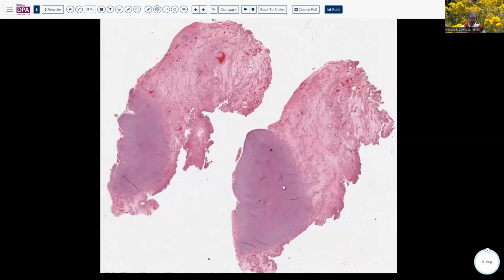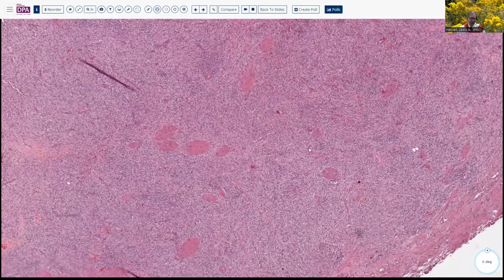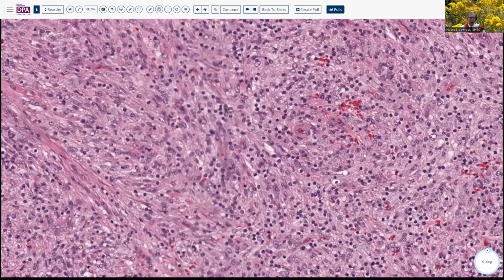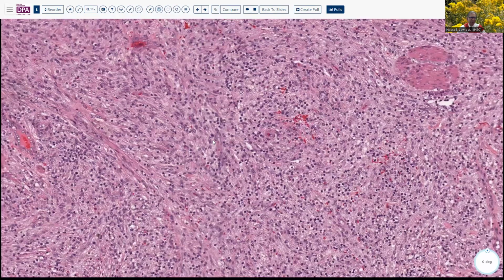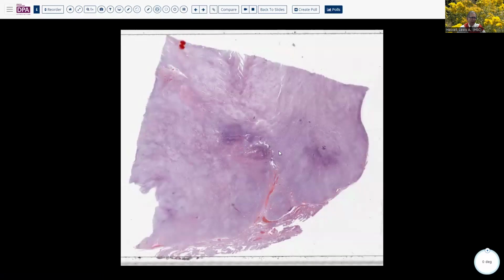And then here, a slightly more deep version, a little bit more cellular, some altered infiltrative appearance around some smooth muscle bundles, and showing you this picture of mixture of cell types with a sort of underlying vaguely spindle cell type of lesion. Now, when we come to immunohistochemistry on this lesion, we tend to get features of myofibroblasts. So we may get a mixture of cell types.